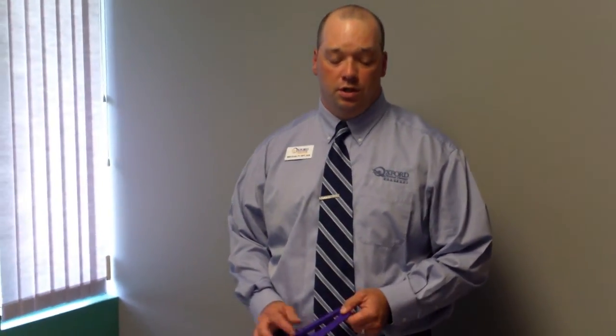I'm here today to talk about sound-assisted tissue mobilization. That's basically where we use these tools to go along injured tissue and we listen for the sound that it might make when we move over scar tissue or fibrotic tissue. These are common findings in injuries such as Achilles tendonitis, lateral epicondylitis, hamstring strains, maybe after surgery if you had a scar. So we use these treatments with lots of different patients.